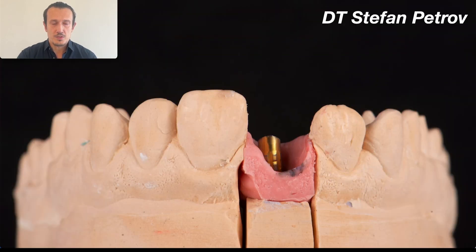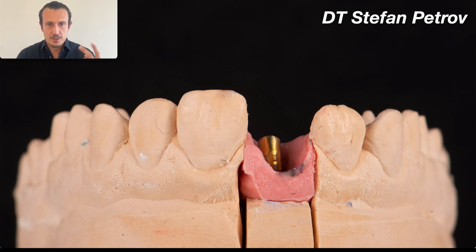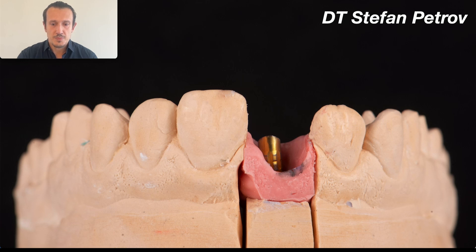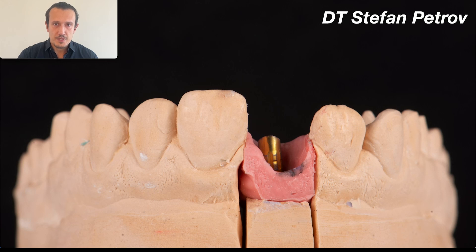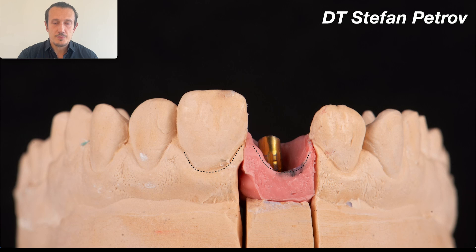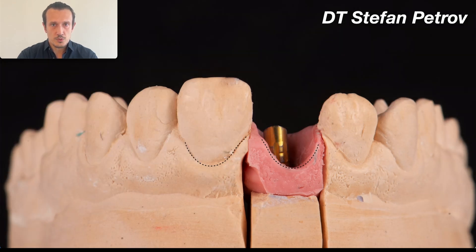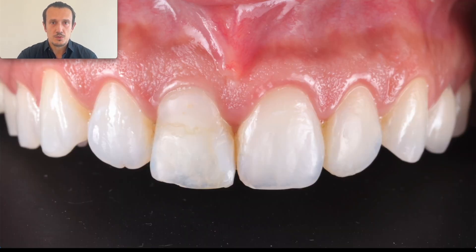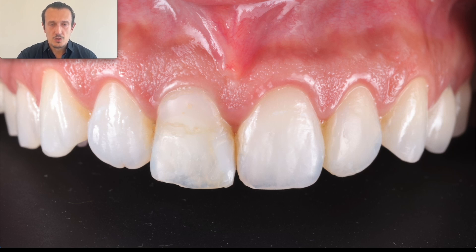Then we go to the lab, transfer the emergence profile, and here is the second step where my technician — in this case Stefan Petrov — performs the reshaping. He uses a burr to reshape the artificial gingiva and creates the last 10% of the form, then copies this into the final restoration.